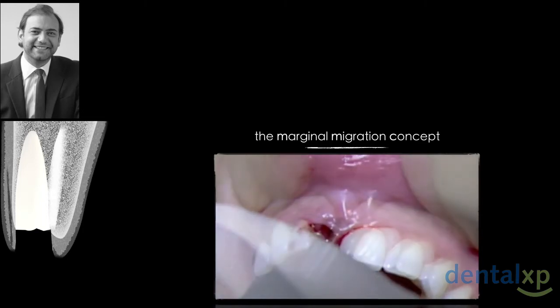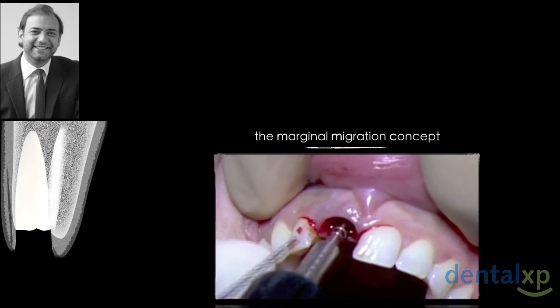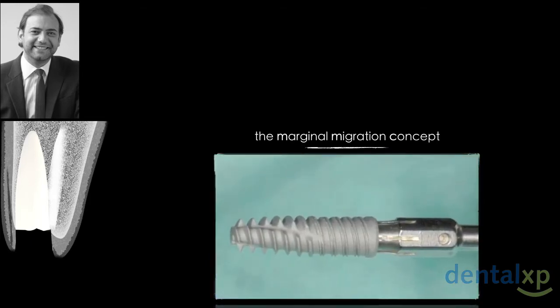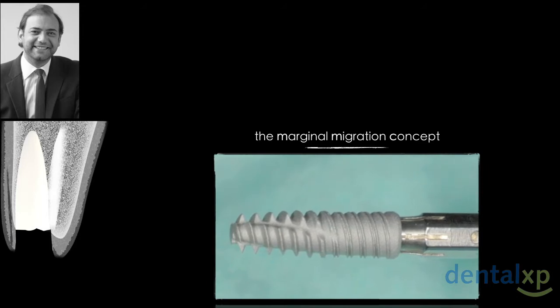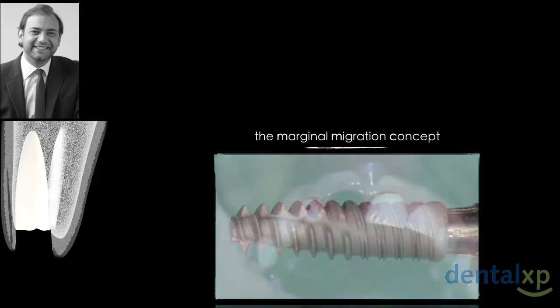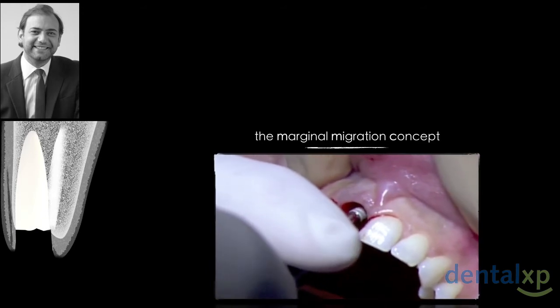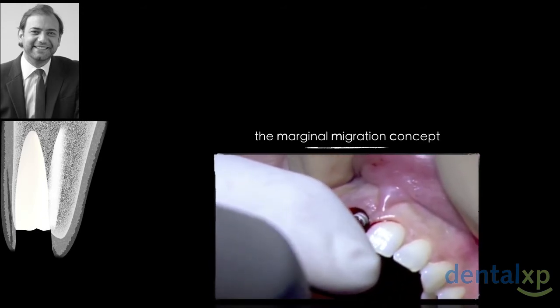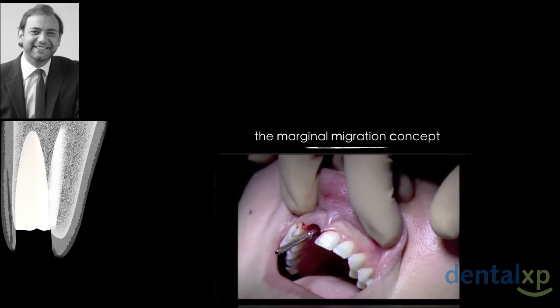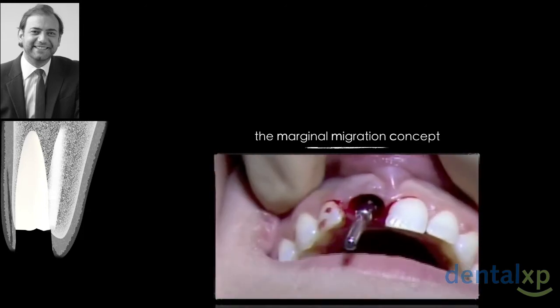So, as you see here on the right side, we stop, we check the depth, the inclination, the direction of the implant, which, as we heard over the last lectures, is so important. This is my in-cone implant with an aggressive apical part, which I need in order to stabilize. And again, I will use hand instruments. This is my left index finger protecting the direction I'm placing my implant. I like hand instruments. And this is the final position of the implant.